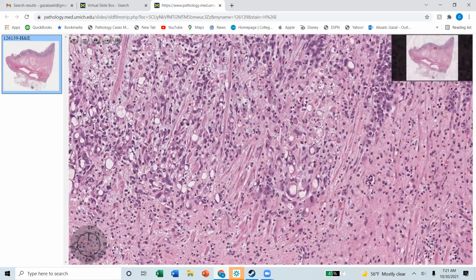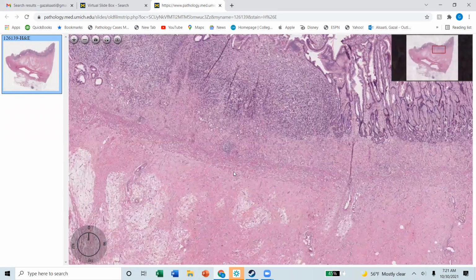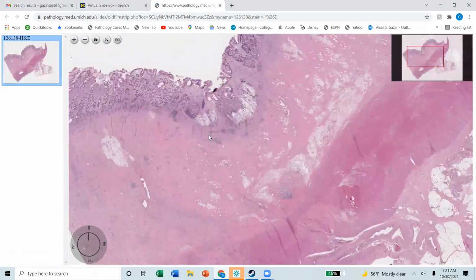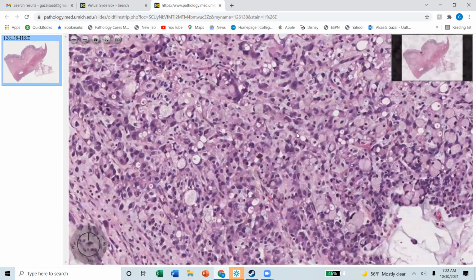Okay. Right. I wish all the tumors are that prominent, but that's not the case at all in signet ring cells. Okay. Intestinal type, no, okay. Oh, that's another one. So I'm going to ignore it. Correct? Okay. All right. So this is just another image on the same patient. Yeah. More of it.